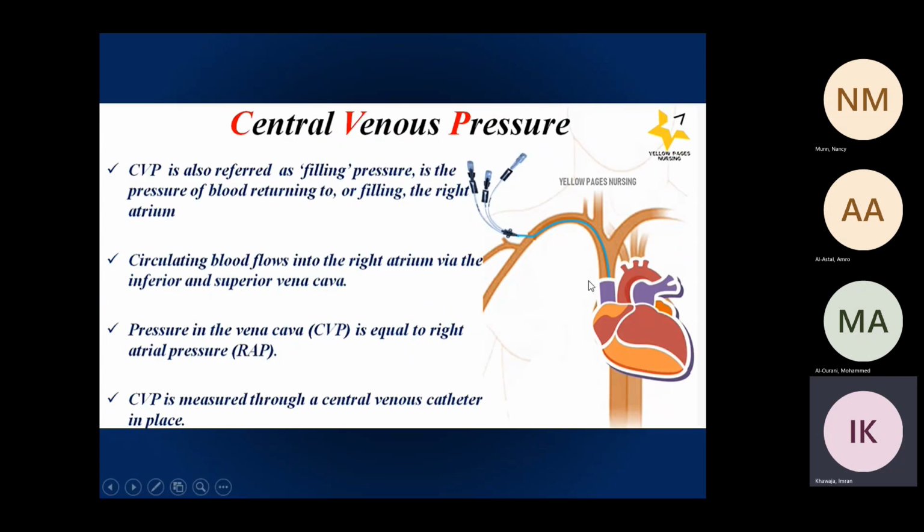Okay. CVP, of course, is the measurement of central venous pressure. We talk about the controversy or limitation as far as reflection of volume status. It does have limitations, and there are studies showing that it does not correlate with the volume status. So as a static measurement, it does not help you in that respect.